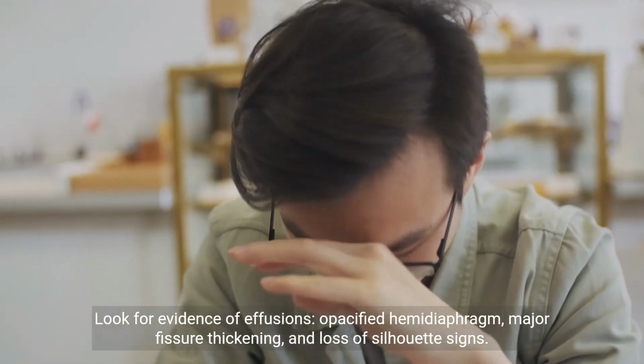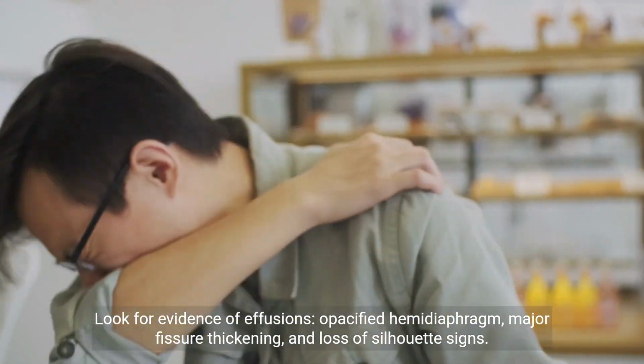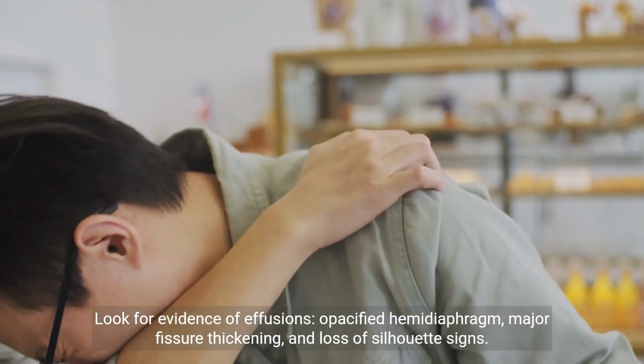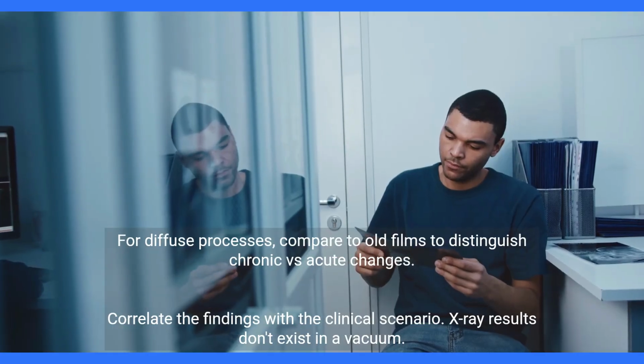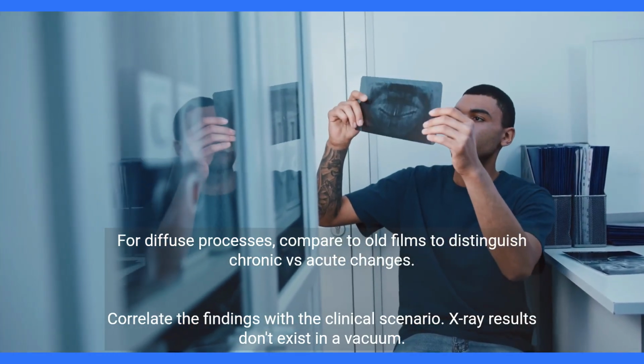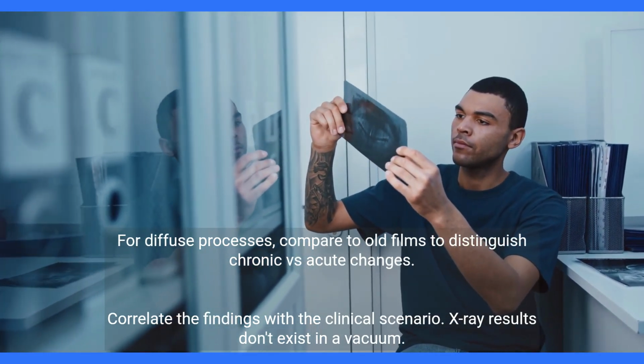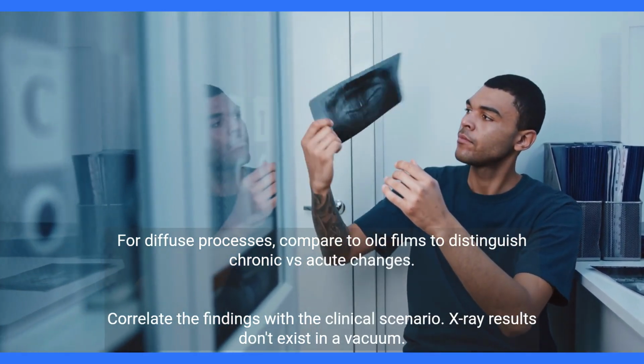Look for evidence of effusions, opacified hemidiaphragm, major fissure thickening, and loss of silhouette signs. For diffuse processes, compare to old films to distinguish chronic versus acute changes. Correlate the findings with the clinical scenario. X-ray results don't exist in a vacuum.